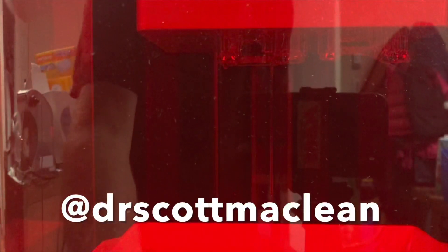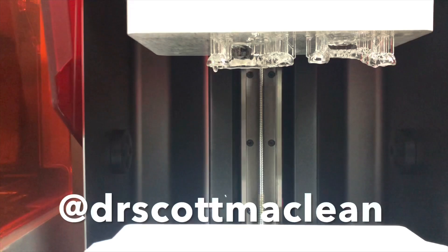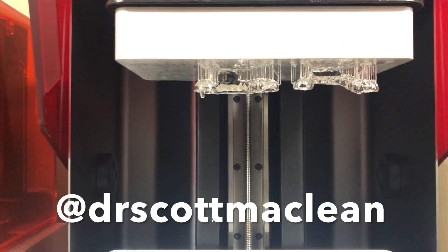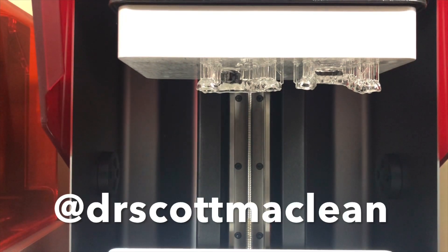You can see that they're starting to take shape, and they've been made by a number of layers. Then my technician Mike is going to take them off and finish by washing them, doing a post-cure, and getting this ready for the patient.